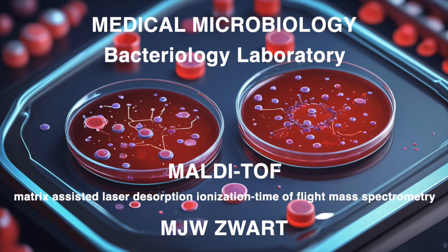Now, you mentioned calibration. It's usually done after maintenance, like a source cleaning. Does it also involve the BTS? Oh, absolutely. The BTS is key for both automatic and manual calibration methods. Automatic calibration, your more straightforward one, relies on the Microflex's software to make adjustments based on the BTS analysis. Manual calibration is usually needed for more fine-tuned adjustments, especially after certain types of maintenance. It involves using specific software commands to tweak the instrument settings. Wow, so precise. So both validation and calibration are crucial for keeping the Microflex in top shape. They're essential. You want your microbial detector to have the best tools and training.